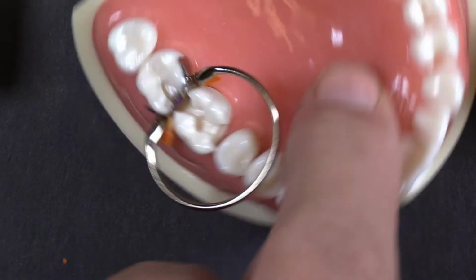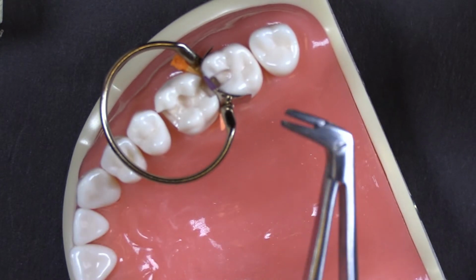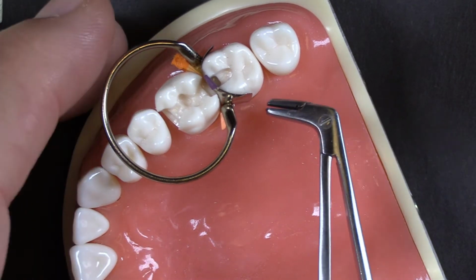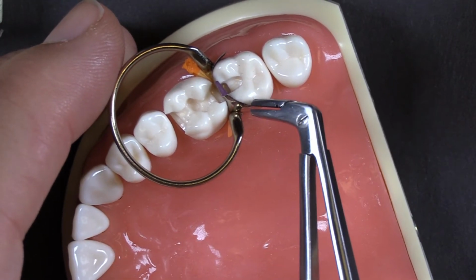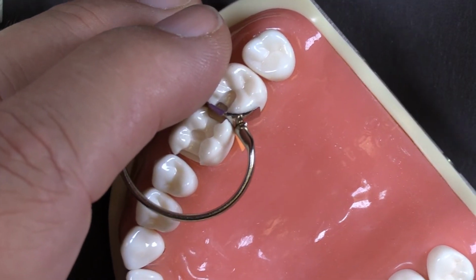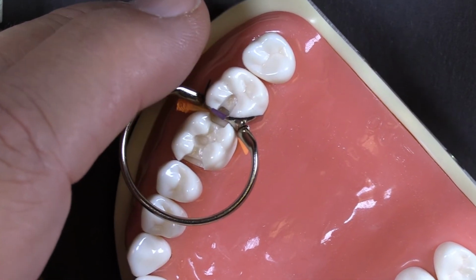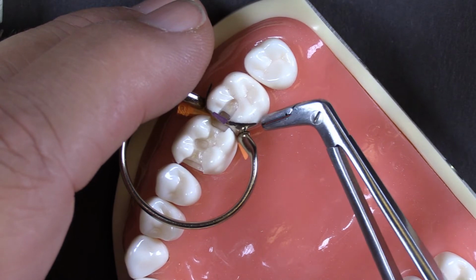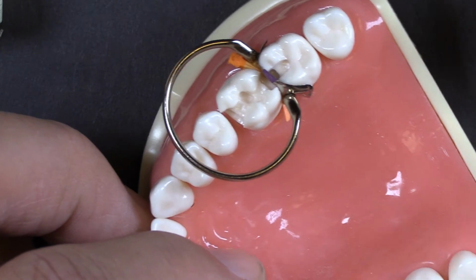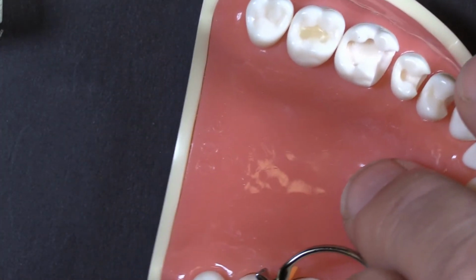If that happens, you can sometimes come in here with this band placement forceps. It's got little carbide teeth in it, so it's got a tremendous grip. You can sometimes reach in here, and if I can grab the end of that band with this, you may have to use an instrument to distend the corner of that band a little bit. You can sometimes get in there and tug that little pucker out by just pulling on one of the ends of the band. So certainly you want to avoid that if you can.